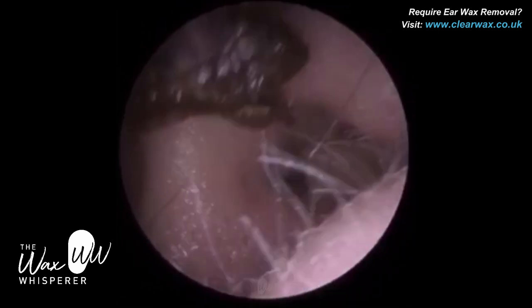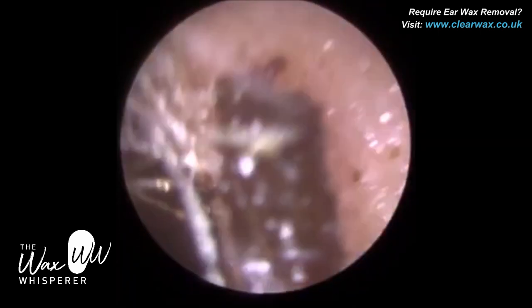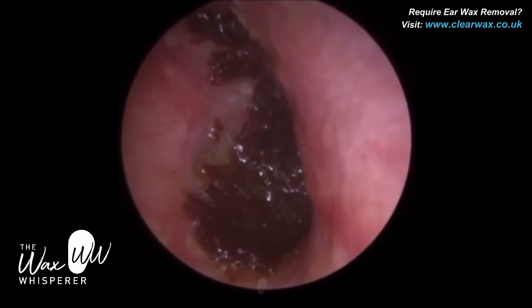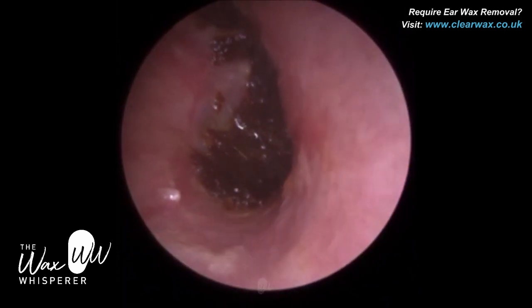We've just gone in with a Zoellner suction probe. The patient had been using a bit of oil prior to attending, so that did help the procedure — it just softened the wax and lubricated it off the tympanic membrane.